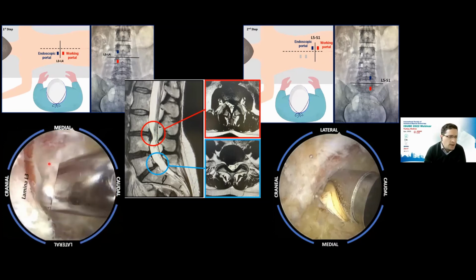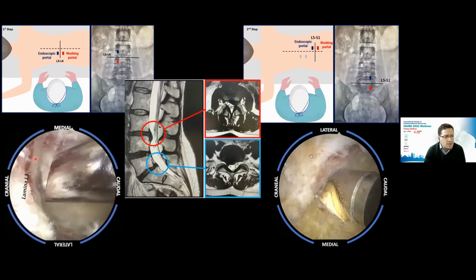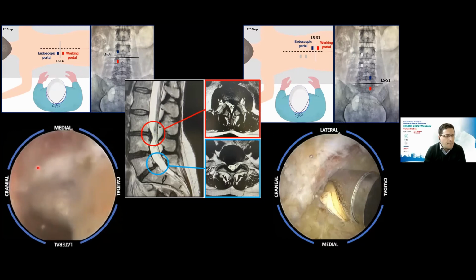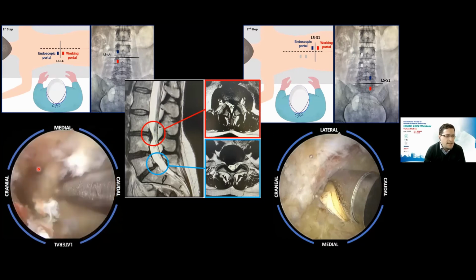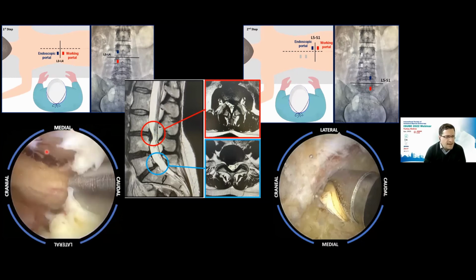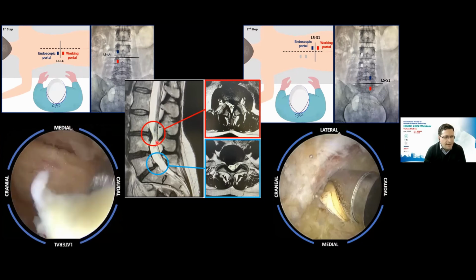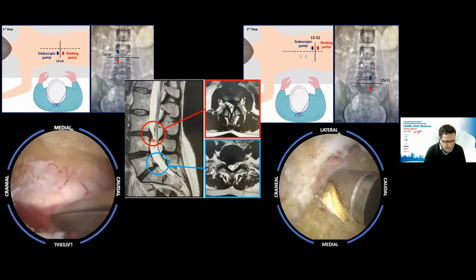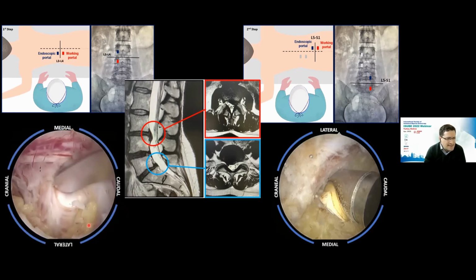We are now drilling the inferior part of the L3 lamina. Then we try to remove all the flavum ligament. In this case, we remove it piecemeal. This L3-L4 hernia has down-migrated and dissects the body of the L3 vertebra. So look at this; it's very, very attached.